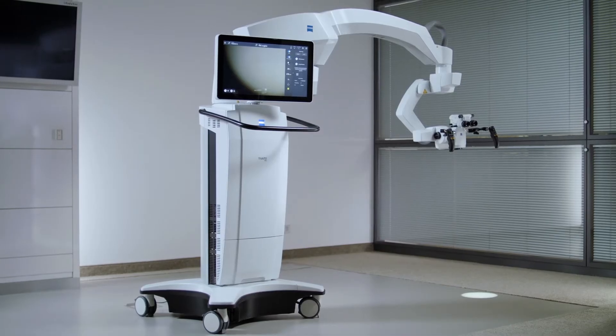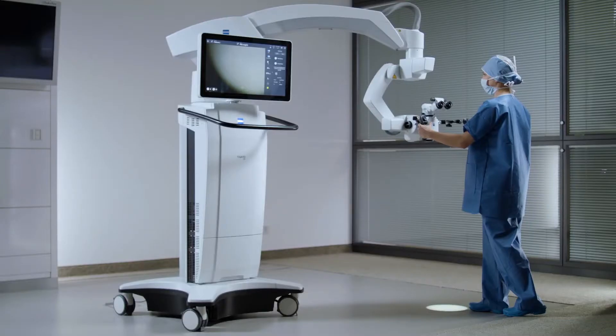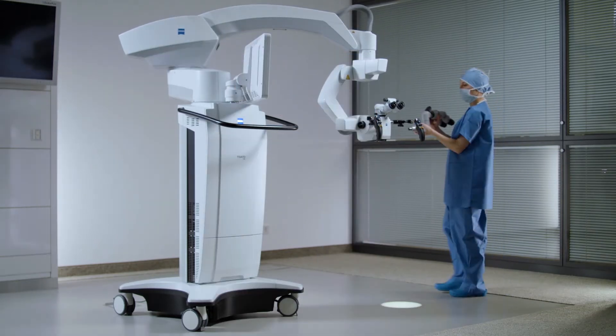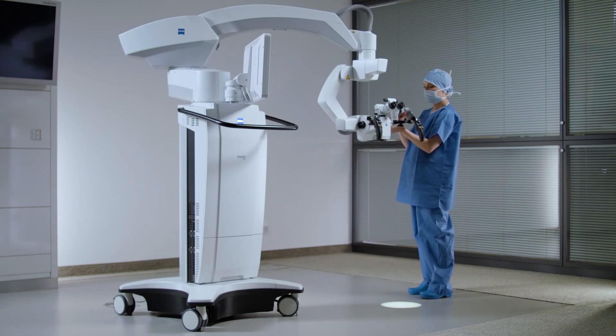The Guided Balance functionality is available for specific configurations of Tivato 700 from Zeiss. After every load change, including co-observation tube or different main tubes, a rebalancing is necessary.